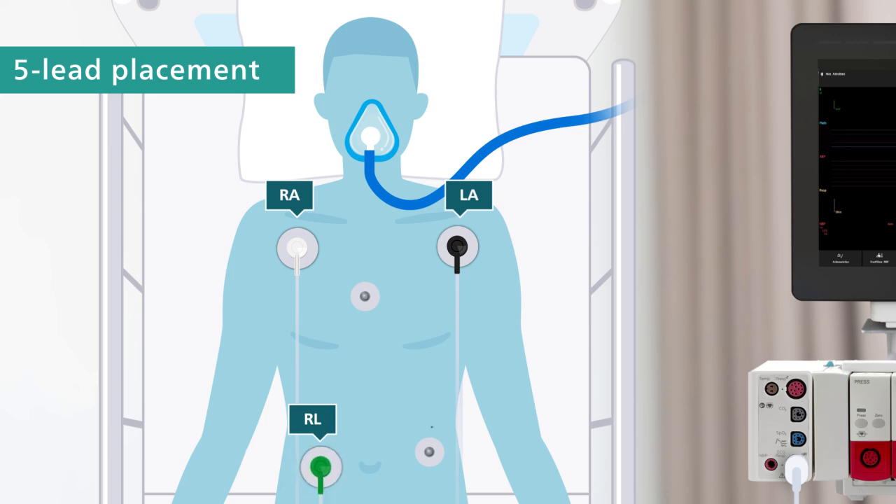The LL lead, red, to the left lower abdomen. And the V lead, brown, to the chest at the fourth intercostal space on the right side of the sternum.